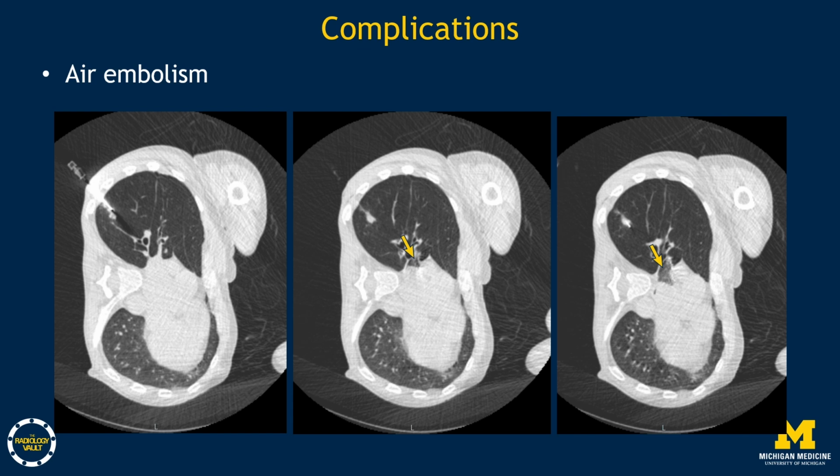This was not appreciated during the procedure as the images were magnified to the nodule in order to provide a precise trajectory. Fortunately, the patient's symptoms resolved while receiving supportive care in the ICU. Pathology revealed organizing pneumonia but no evidence of organism growth.